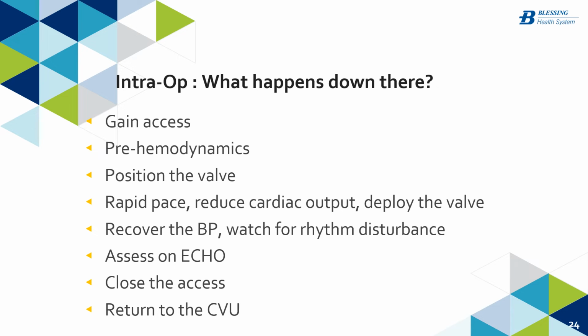So if everything looks okay and we're happy with the way the echocardiogram looks, with no perivalvular leak and no other interventions needing to be done, then it's just a matter of closing the access, and then they'll be returning to the CVU.